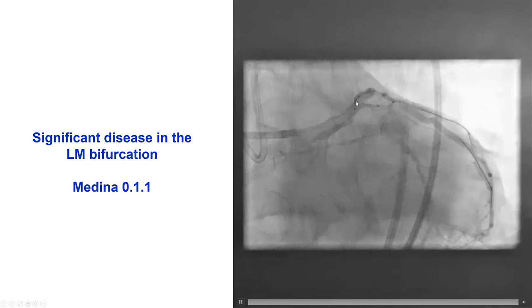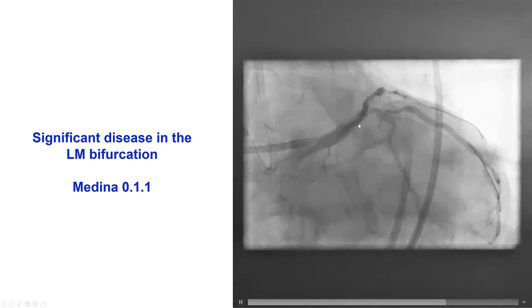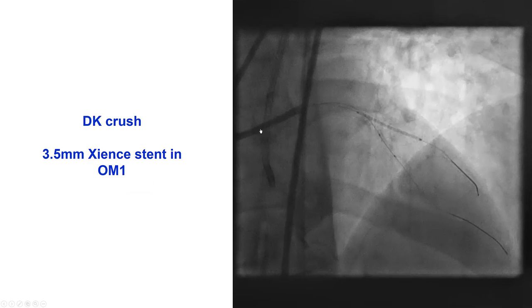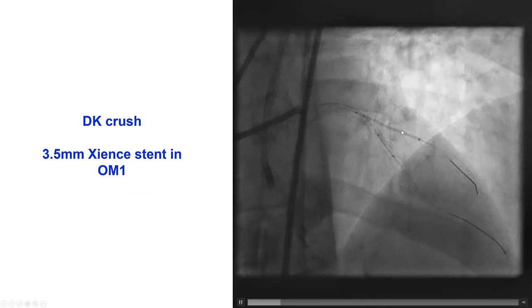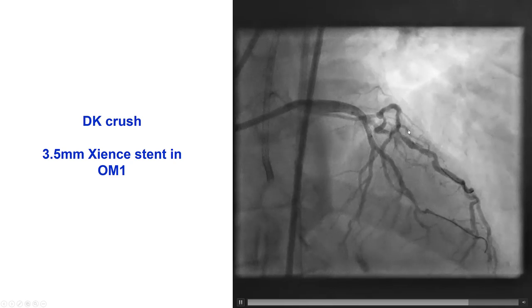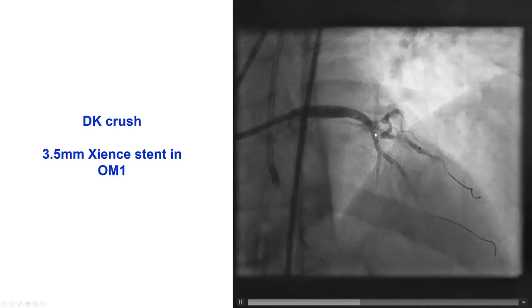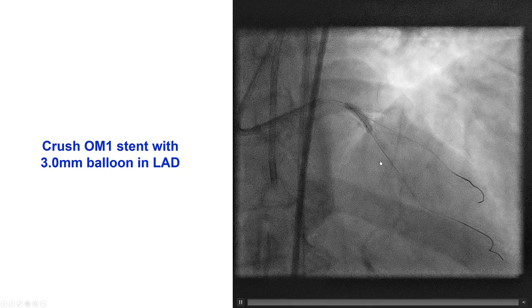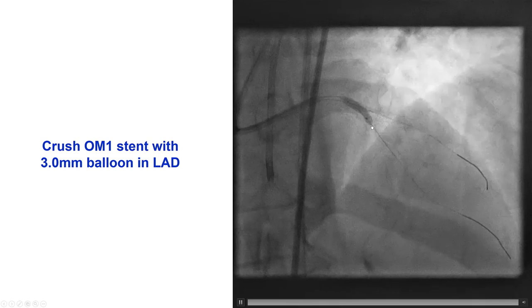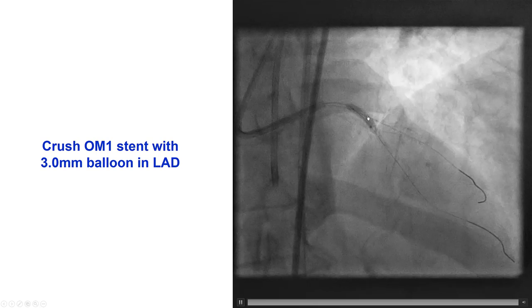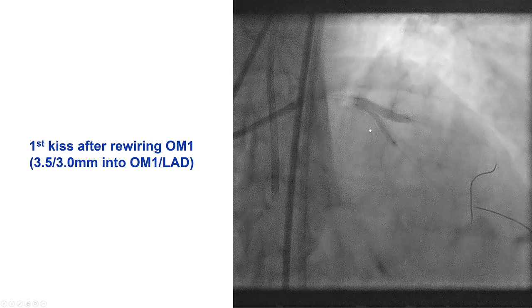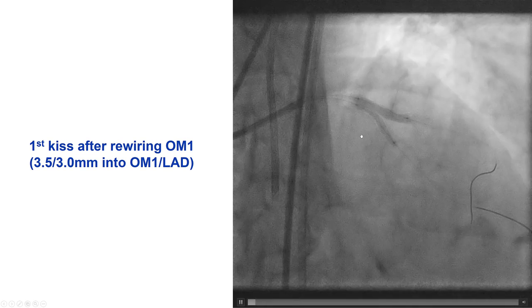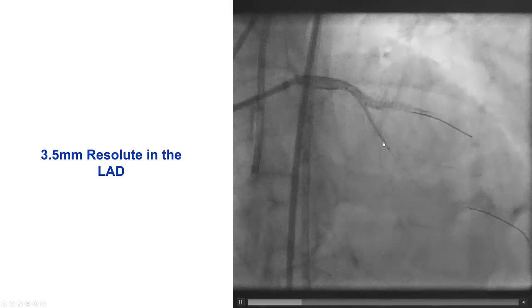This was a Medina 0-1-1 bifurcation, and we decided to stent it using the DK crush technique. We prepared both lesions, placed a 3.5 stent into the large obtuse marginal branch with a balloon in the LAD. The stent was deployed and a good result was confirmed. We came back with the LAD balloon and crushed the stent that was protruding into the left main, and then rewired for the first kissing balloon inflation, which went well.